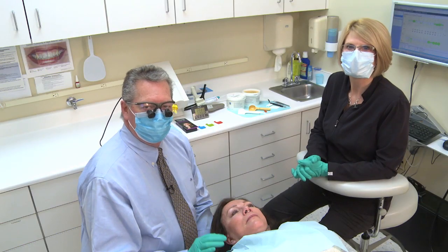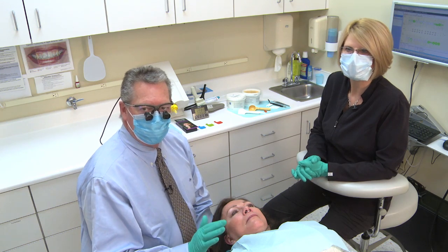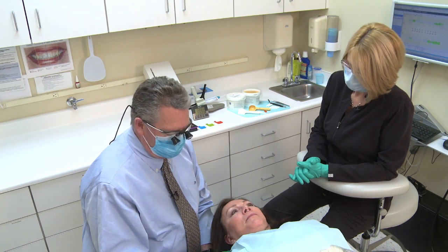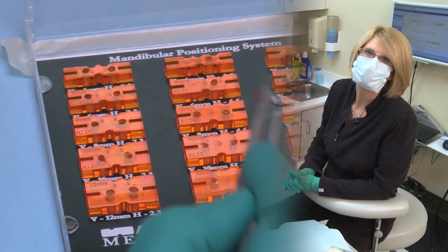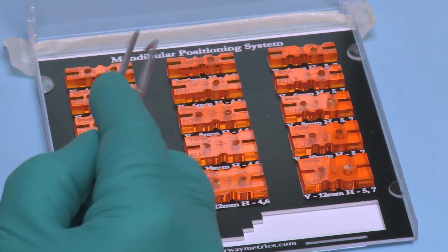Let's see the response of the Mute nasal dilator without any bite registration component in place. So Kim, go ahead and give us your best snore. What do you think, Tammy? It's better. It is better. It's better, right? Let's go back to the Airway Metrics system.